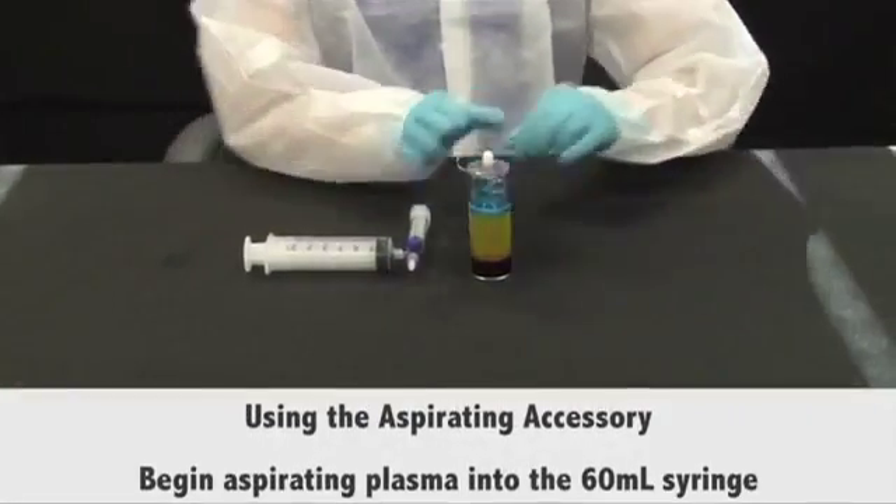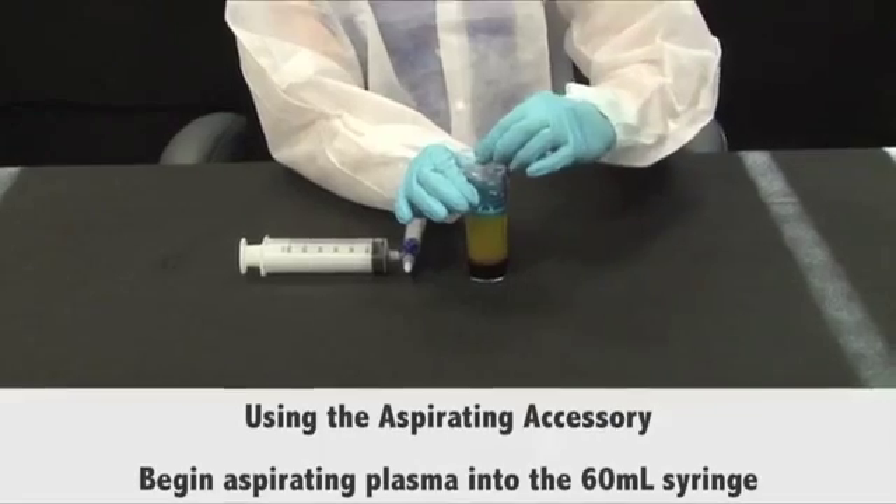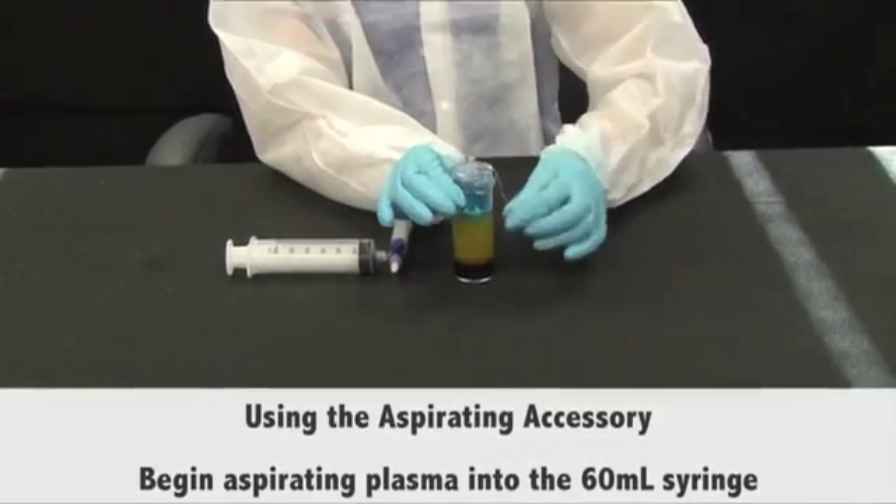Using the aspirating accessory, aspirate plasma into the 60 milliliters syringe.